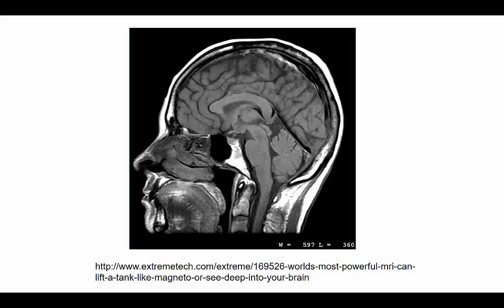This is one example of MRI images. First of all, you can realize that this is a tomographic image, right? This is a sectional image, like one made by CT. Comparing to X-ray CT, what is the biggest difference here? Well, X-ray CT shows you only bones, but in MRI, we can see the soft organs such as the brain.